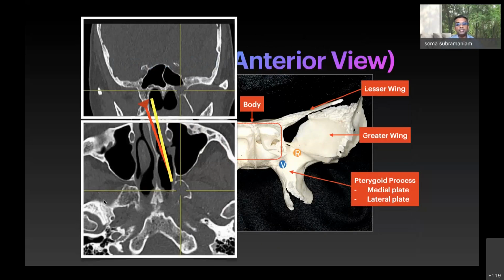All right, so now in terms of the approach, do we use one nostril to try to attack this area? Or would it be better to try to use a two nostril approach? All right, so you can see how crowded it is when you put an endoscope, a suction, and cutting instruments on one nostril. So what we can do instead is actually to use both nostrils so that you get a wider angle of attack and the instruments actually don't fight with each other.